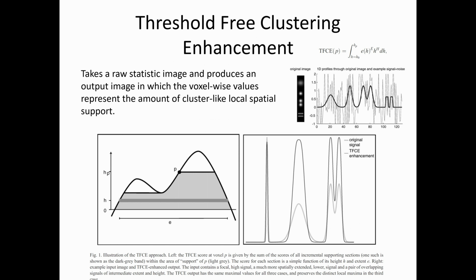The idea is that when you set a hard threshold of what you consider significance across your data, you can get little spikes that you believe will be significant or not, and you cluster those together where they touch. But there's a lot of noise on top of your data, and you won't be reading that situation exactly right.